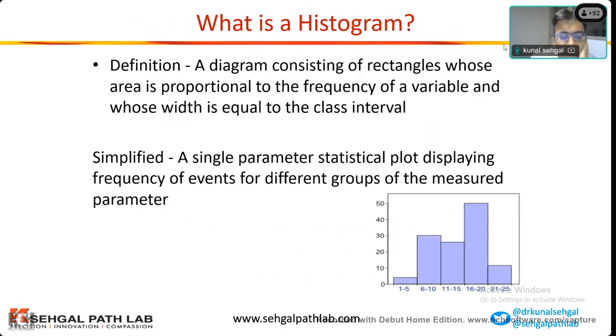Again, before I start, I have no conflicts of interest to disclose. While I show graphs and histograms from a particular machine, again, this is just for ease of teaching and sharing. This is not marketing or propaganda for any particular company.